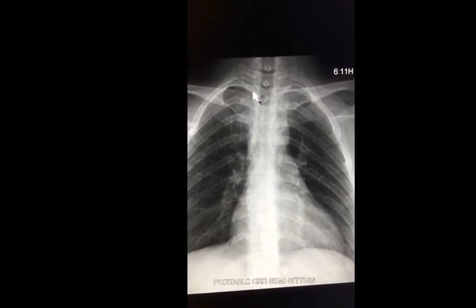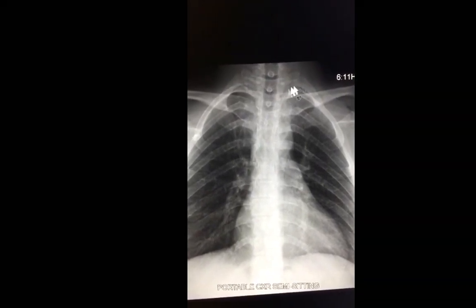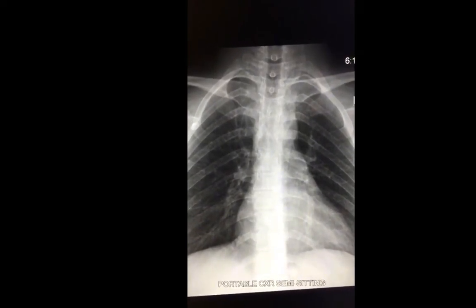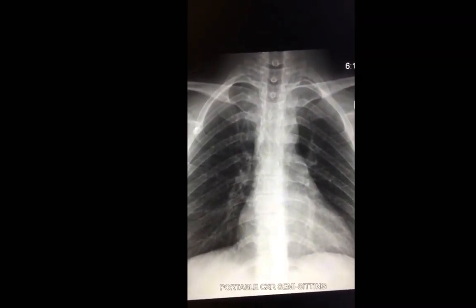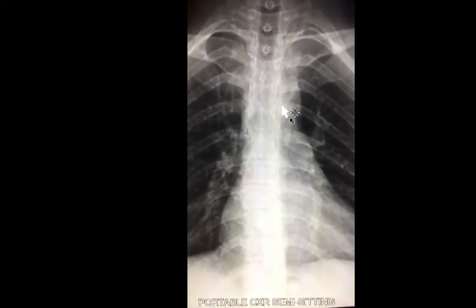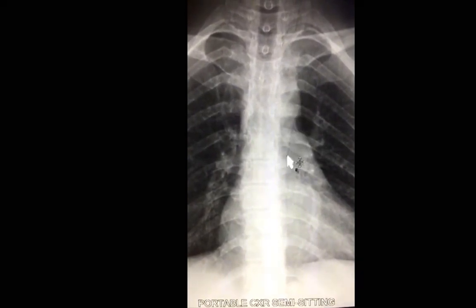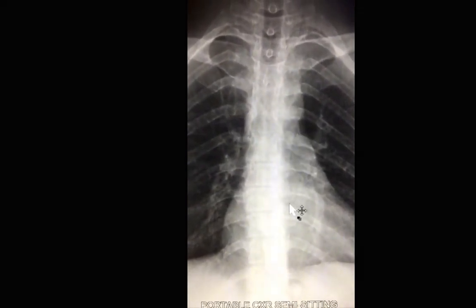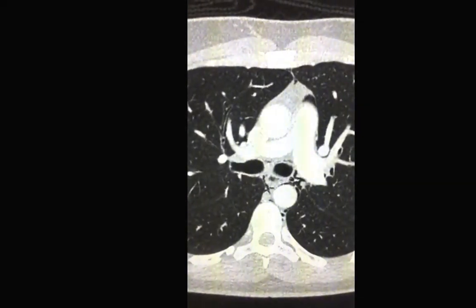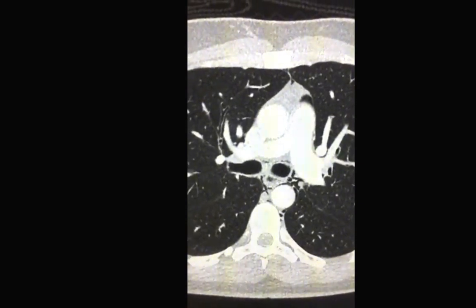Don't miss soft tissue abnormalities such as subcutaneous emphysema. If you see subcutaneous emphysema, make sure you don't have a pneumothorax, pneumomediastinum, or pneumopericardium. Abnormal linear or curvilinear mediastinal air lucencies that may outline the descending aortic contour are signs of pneumomediastinum. CT scanning is a better way to show these abnormalities, and if pneumomediastinum is seen, make sure that the esophagus and the tracheobronchial tree are intact.